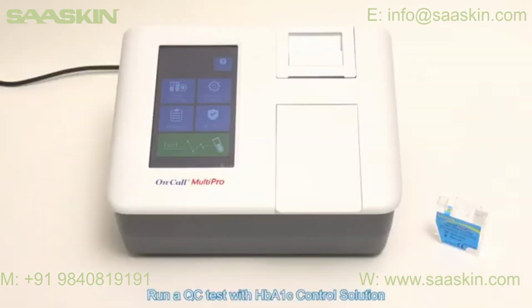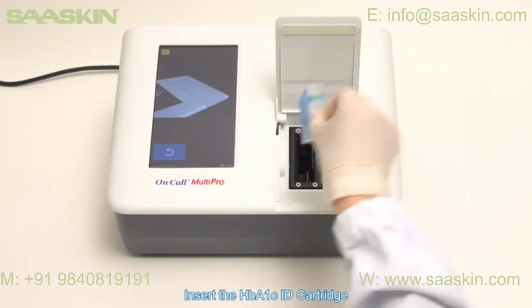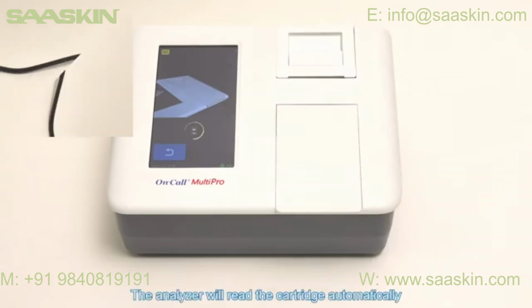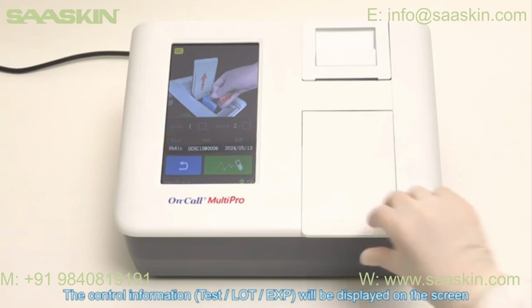Run a QC test with HbA1c control solution. Click QC test button on the home screen. Open the cover. Insert the HbA1c ID cartridge into the cartridge compartment with label facing left. Close the cover. The analyzer will read the cartridge automatically. The control information, test, LOT, EXP, will be displayed on the screen.